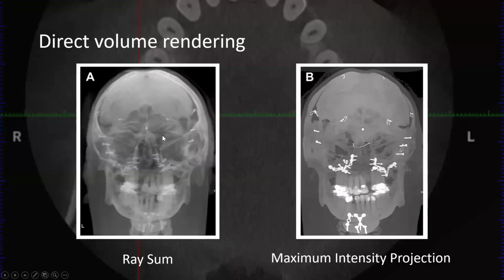video card dependent. All right, so this is your typical one. It's called ray sum, which is basically creating a cephalometric projection. It's summing up all the voxel values. I haven't talked about voxel yet, but all of those points throughout the volume in one direction. And of course, you can change the alignment. So this is kind of recreating a PA ceph, but you can change the orientation.